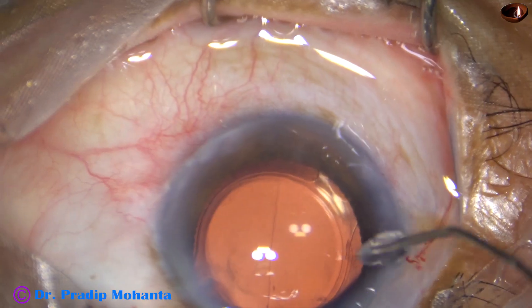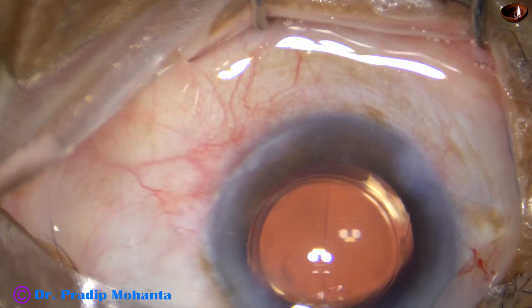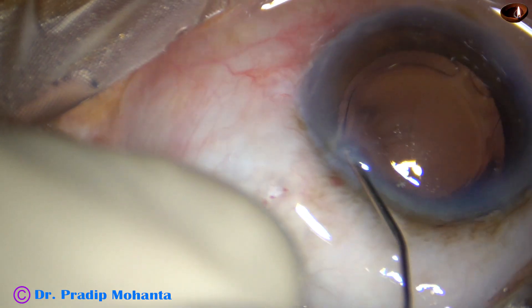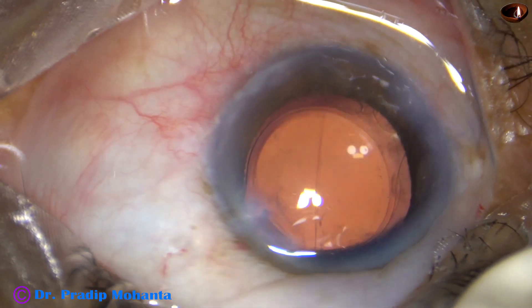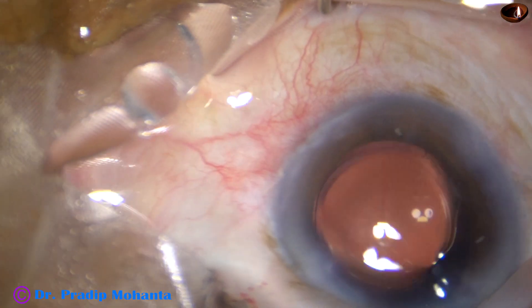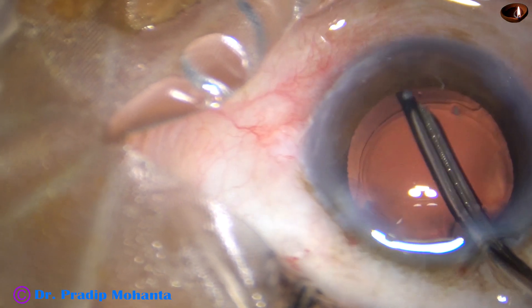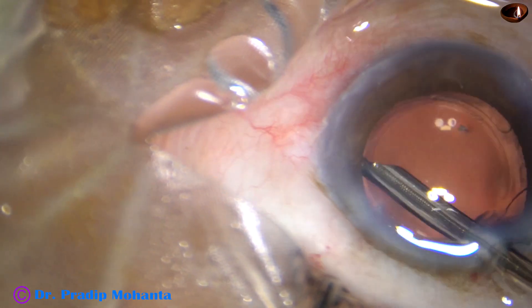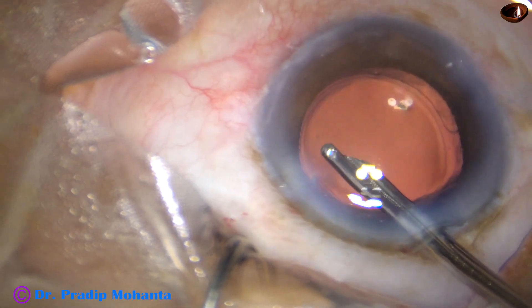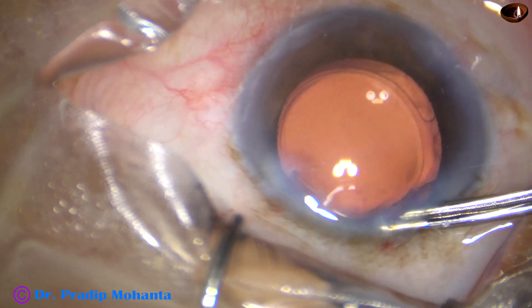And now I hydrate the side ports. Hydrate the corneal stroma, and thus I close the side ports. And then I take a 23G Simcoe cannula and do some polishing of the under surface of the anterior capsular rim. I go below the anterior capsular rim and do some polishing. At this time some lens fibers come out. And the chamber is nicely formed then, and the case is concluded.